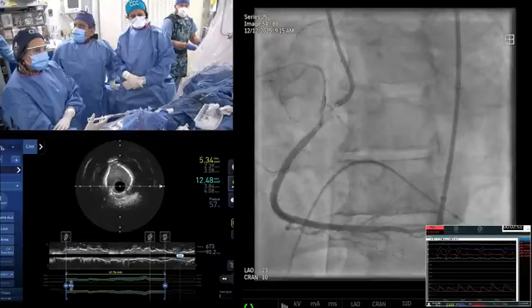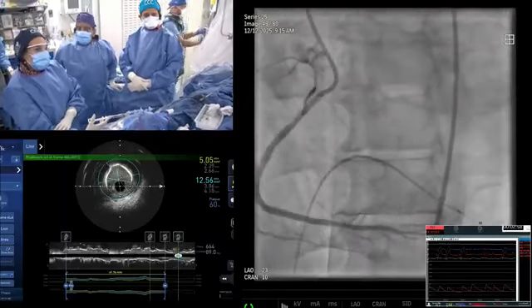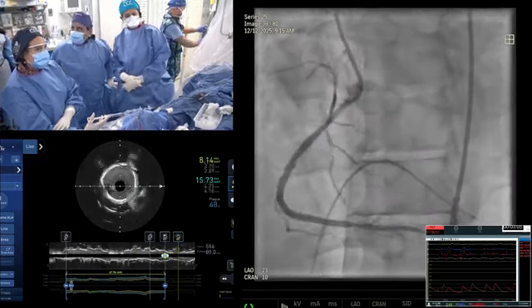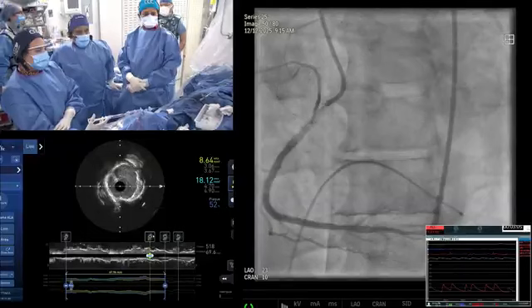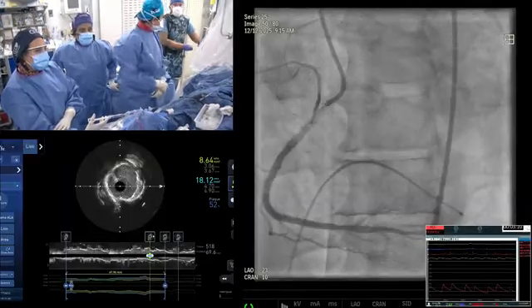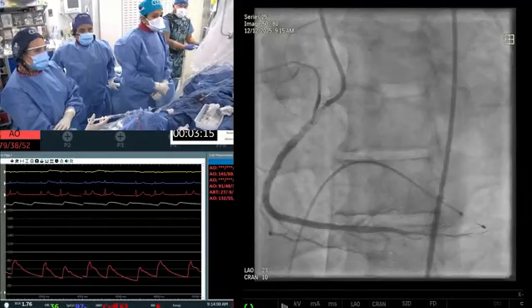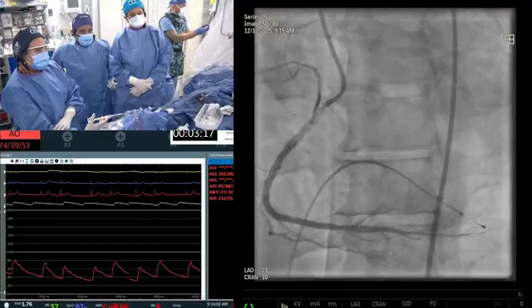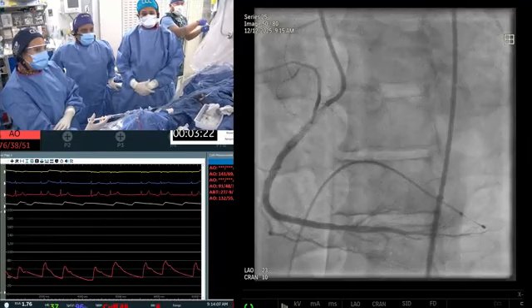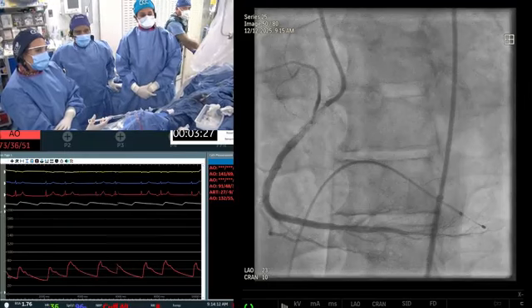So clearly now the IVUS has been done, angiography has been done. Make the hemodynamics a little bigger now and see whether the patient was requiring some pacing. We have given atropine, but not aminophylline. If there's any question, you can end up with aminophylline. But this is okay now. It looks all right. Atropine? Maybe it doesn't work in this guy. No, but this much calcium. No embolization. Atropine is not showing that he's getting atropine. No, but that's okay because without that he was a little troublesome.